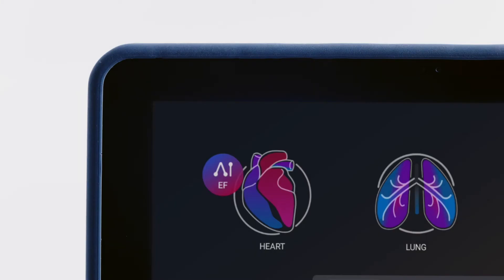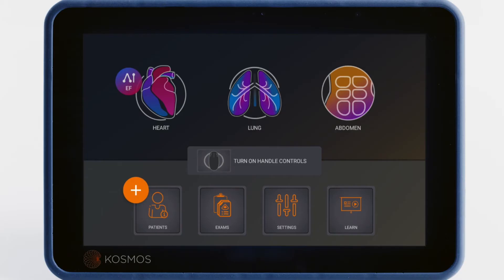The EF button on the heart icon will take you to our AI-assisted EF workflow, which we discuss in Video 5. Tapping on any of these icons will immediately take you to scanning. We review ultrasound modes and adjustments in Video 3.